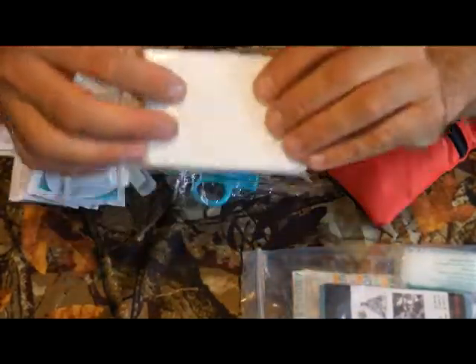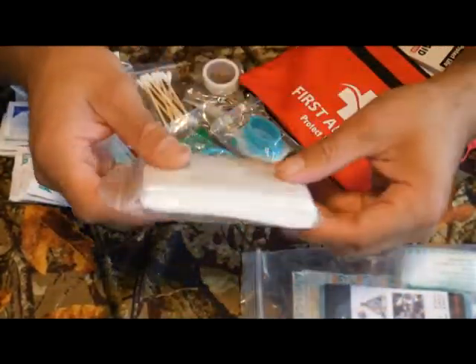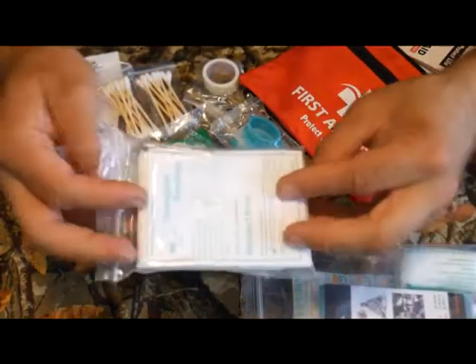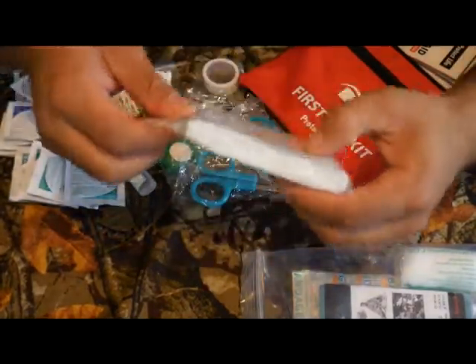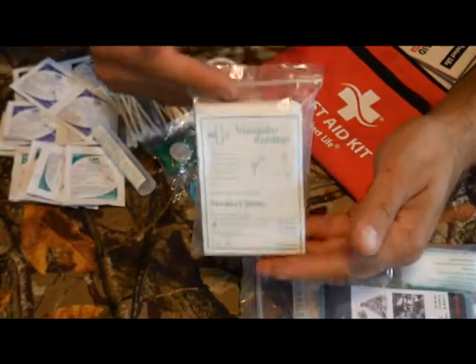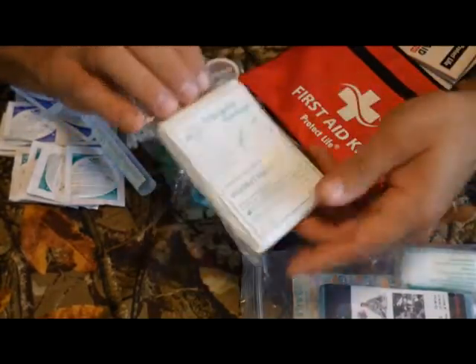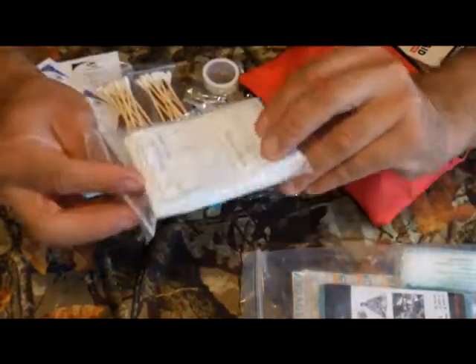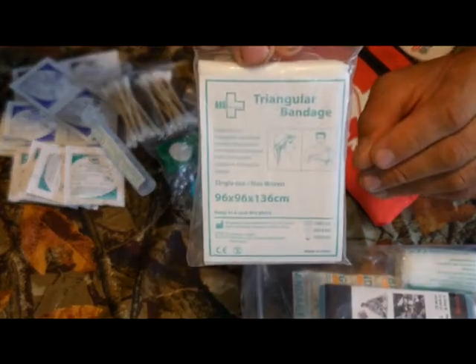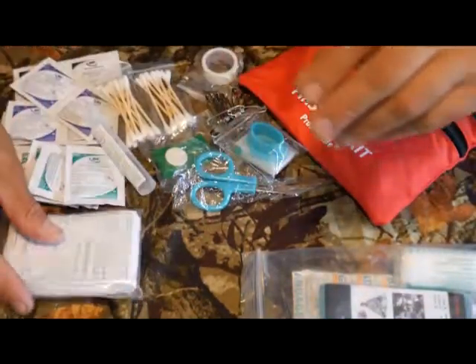Here's the triangular bandage, which is great. Instead of just gauze — which has limited use in a small compact kit — I'll often choose one of these. It's basically a first aid version of a bandana: very versatile, can be configured many different ways. It has survival uses too. There's even a little illustration showing how to use it as a sling for an injured arm, and that's also what the safety pins are for.